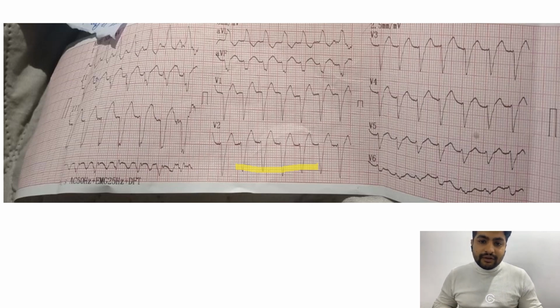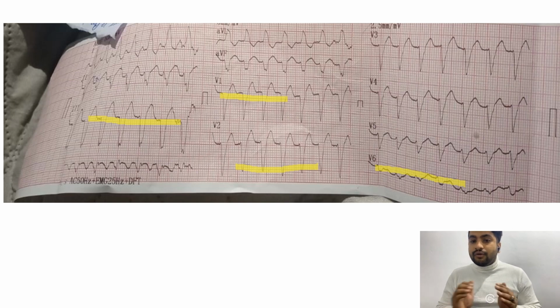But if we look closely, this is our V1 and this is our V6. They are different in morphology from each other, and if we look closely at lead 3, after the T wave there is a small flicker of P wave. If you zoom in on your video right now, you will see small flickers of P waves in lead 3. So there is some atrial activity, and the overall morphology of this ECG doesn't go with VT. So this is our left bundle branch block.